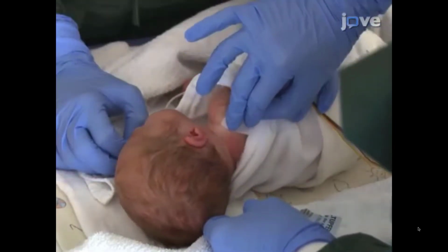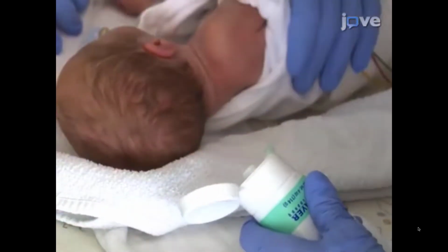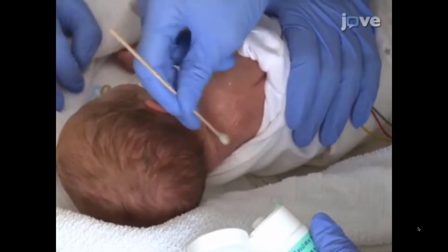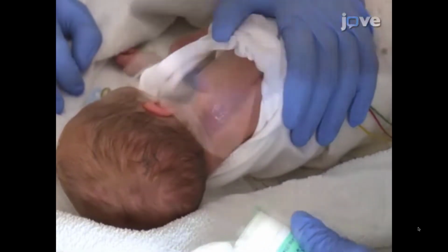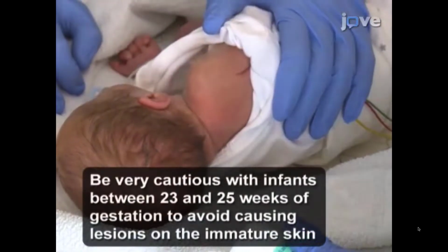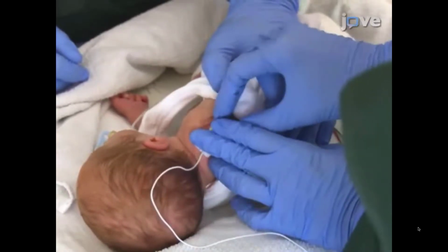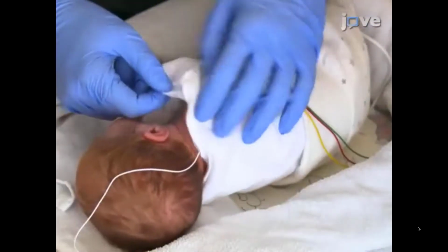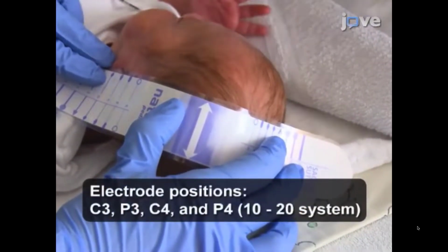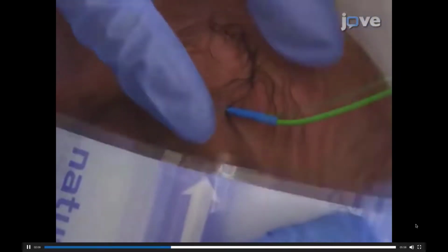Apply the electrodes during routine care by first disinfecting the skin. Then place skin preparation gel on a cotton swab until it is moist. Apply a few gentle strokes with the cotton swab, using very little pressure. Then place the reference electrode on the back or the chest of the infant. After the reference electrode has been placed, put the measuring device on the infant's head and line up the same signs on the infant's tragus and sagittal suture.